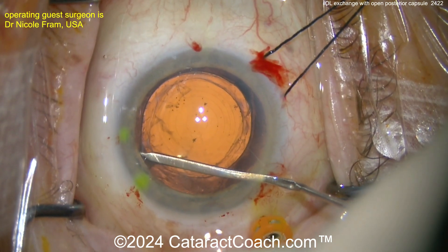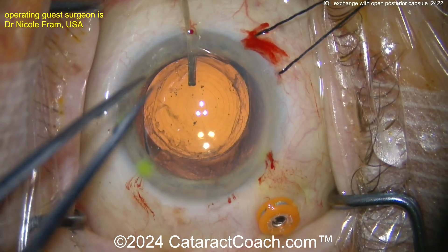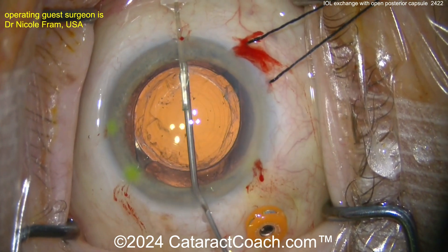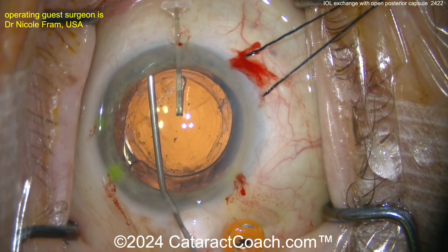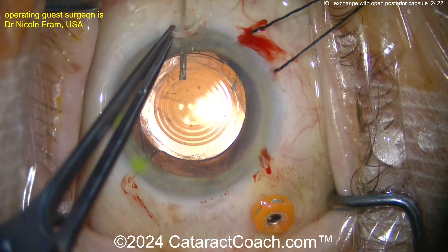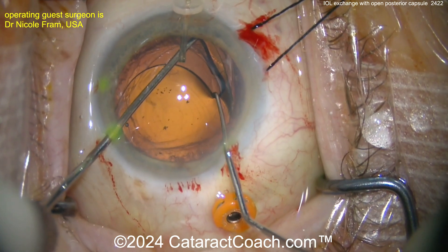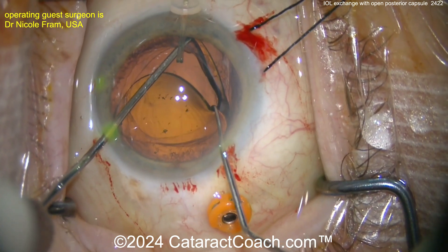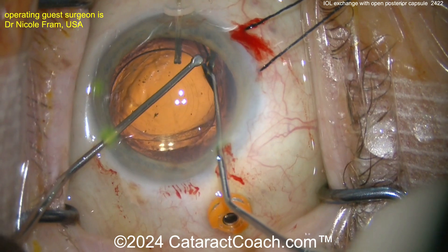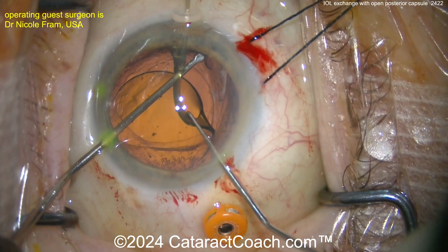She's going to dissect open the capsular bag carefully. Now this is smart — this is genius actually — placing a capsular hook to help give you counter traction as you dissect the IOL from the capsular bag. And look at the top right corner of your screen: that looks like a 5-0 or 6-0 silk traction suture. The capsular hook is providing support to the capsule edge as you dissect out the IOL.